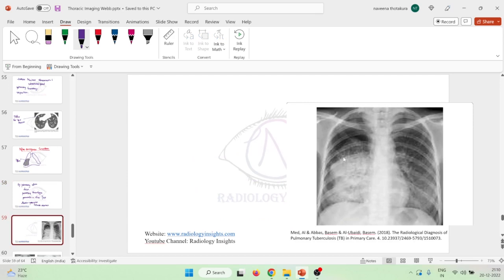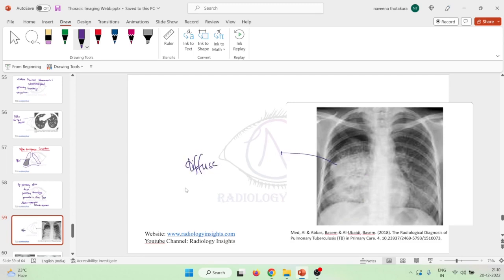In this picture, you can see the diffuse homogeneous opacity. The heart border is seen clearly here. If it were not seen clearly, we could say it is a silhouette sign, but actually it is not. This consolidation is diffuse because it is present over most of the lung, and it is homogeneous because the whole opacity has the same density — so it is diffuse homogeneous consolidation.